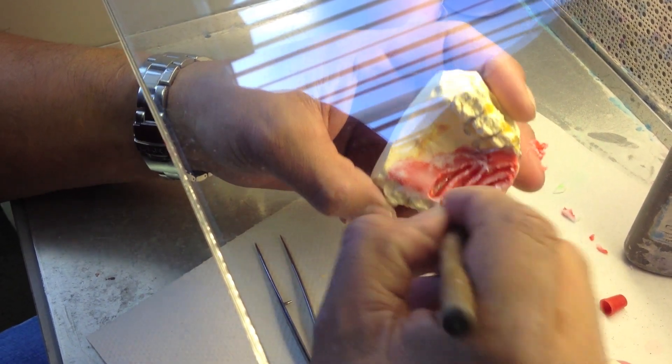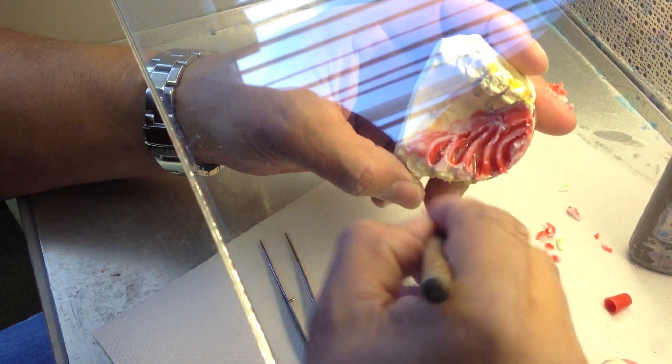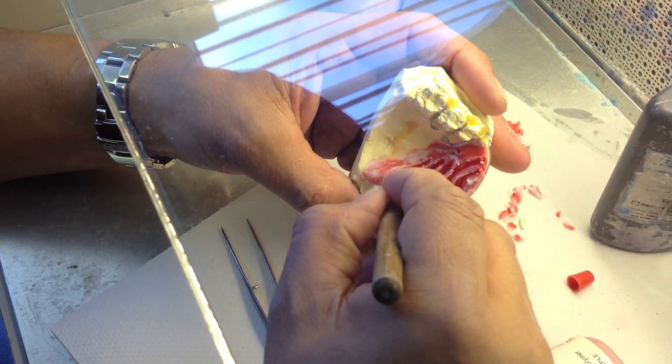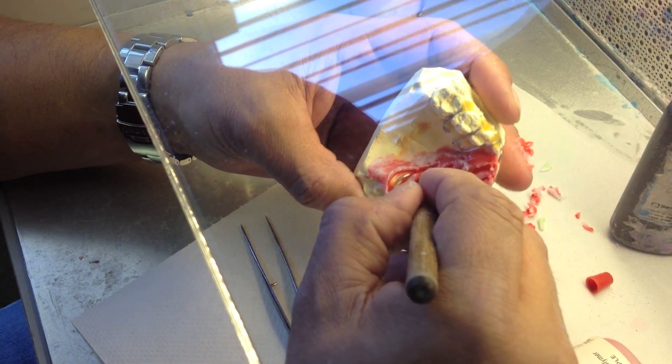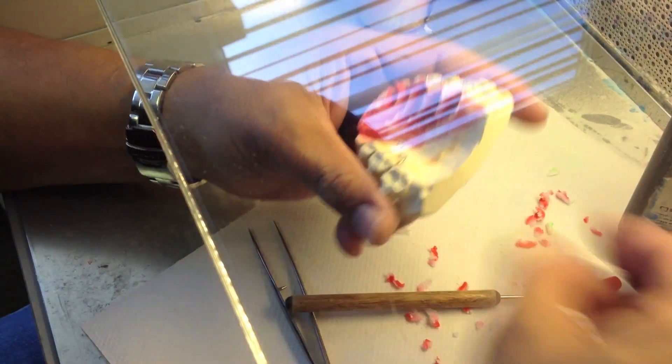He uses the same size tool every time so the trenches are the same size. Pretty much no matter what size the mouth is, a bigger mouth is going to have more stripes. He makes them the same distance apart from each other so there ends up being a red stripe, black stripe, red stripe, black stripe, and so on.